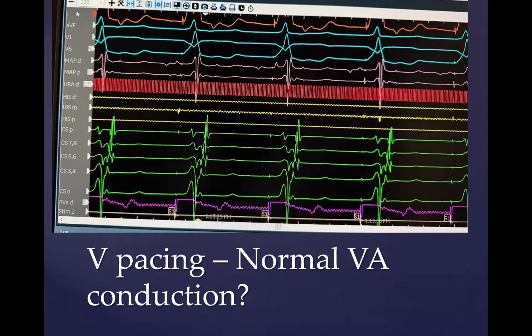So it looks like the earliest signal is coming from the RV channel. The earliest what? I'm sorry? The earliest V. Yeah, that's true. Well, that's because we're pacing in the V, right?